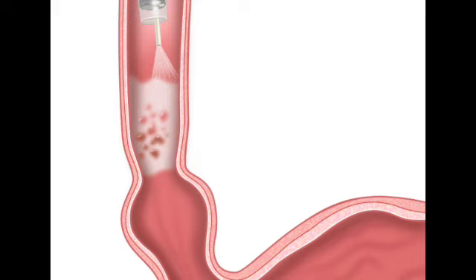We took a journey today from a basic 20 cc syringe filled with household vinegar to the brilliant, high-contrast mechanics of acetowhitening. We sure did. We learned how the temporary clumping of proteins causes healthy tissue to put on a white disguise, and how dangerous, chaotic cells lose that color rapidly, acting as a secret fading map. A race against time. Right.